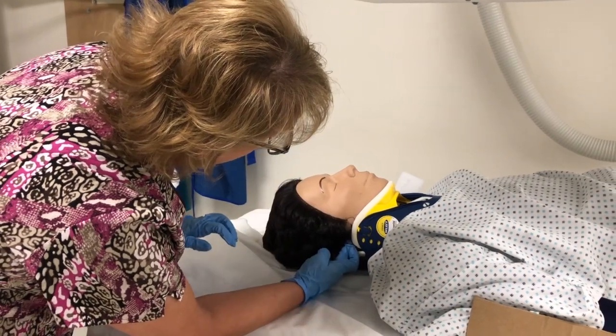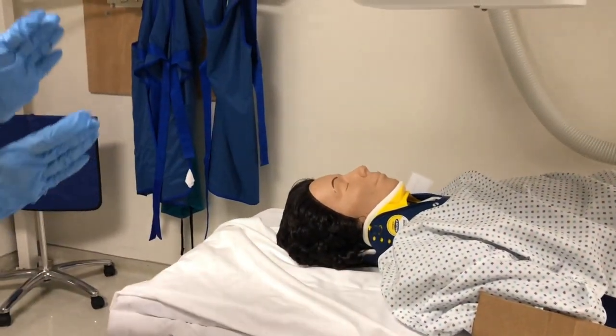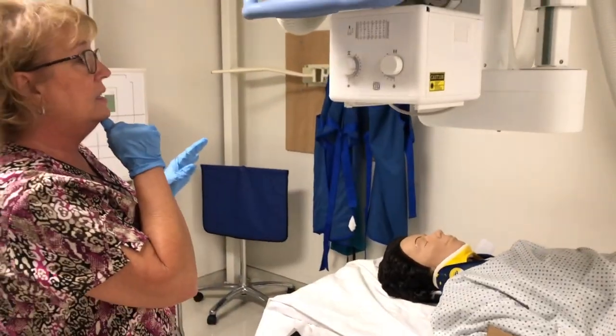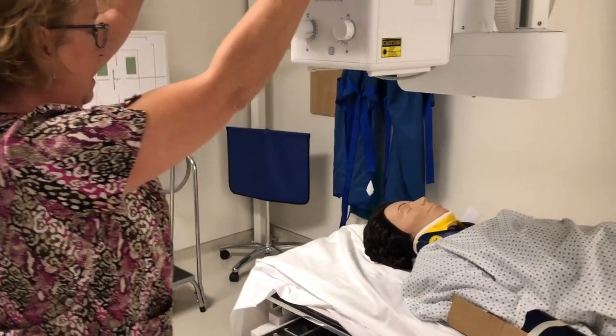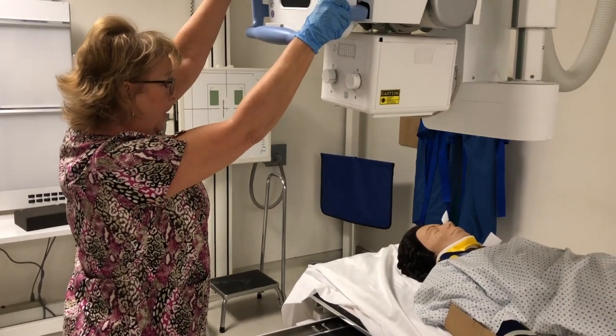So it looks to me like from mastoid tip to bottom of teeth, there is a slight angulation. If this patient wasn't wearing a C-collar, I would extend her chin up, but because I can't do that, I'm going to match that occlusal plane with my CR.